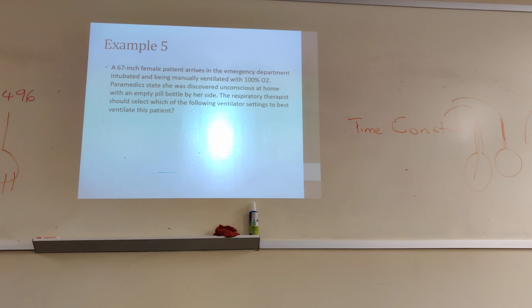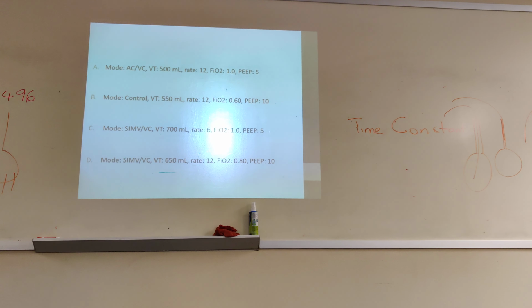Well, I know that they came in with 100% oxygen. They're being bagged with 100% oxygen. So I'm going to put them on the same FiO2 of 100%. Okay? 67 inches, that would be 64 kg. So we figure out the tidal volume.